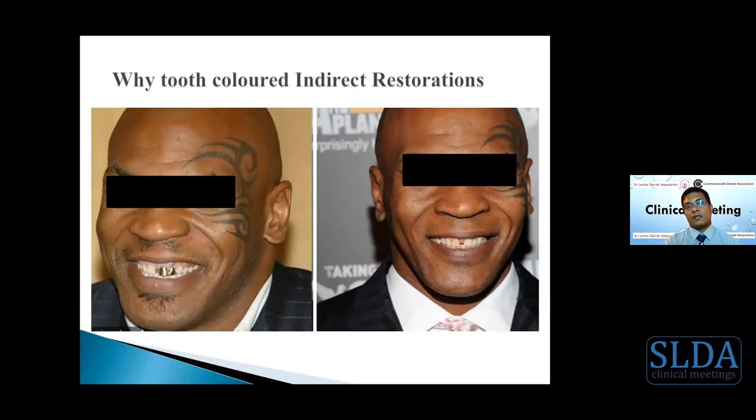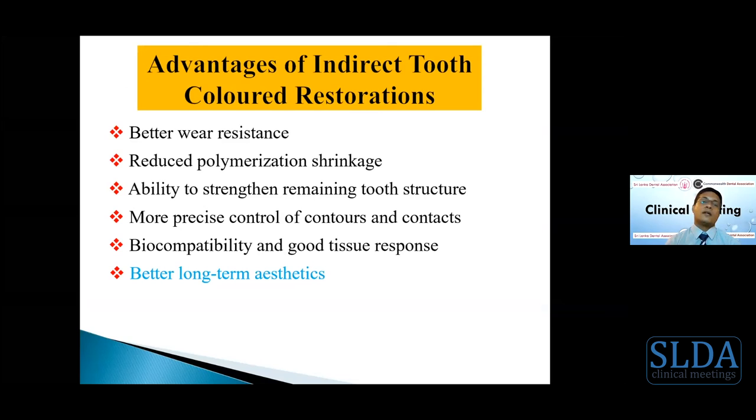Because of that, resins and ceramics are increasingly popular among patients now. Therefore, I will talk more about tooth-colored inlays and onlays and their preparations. But before that, I would like to introduce some of the pros and cons of tooth-colored indirect restorations.